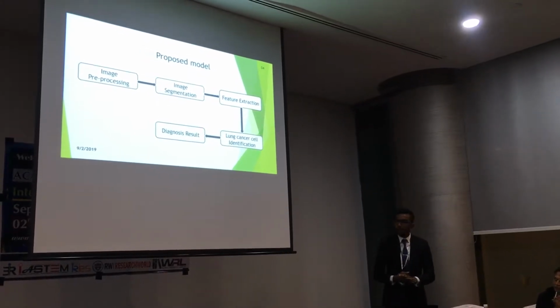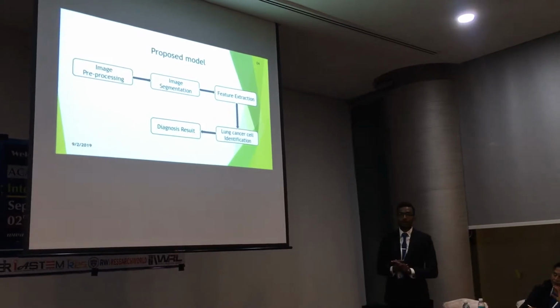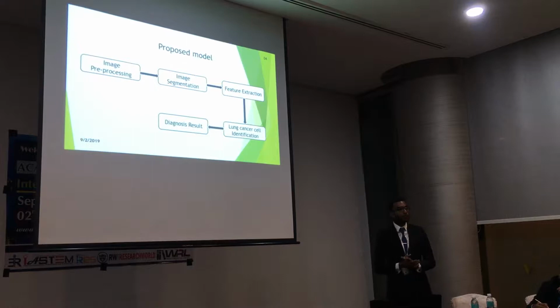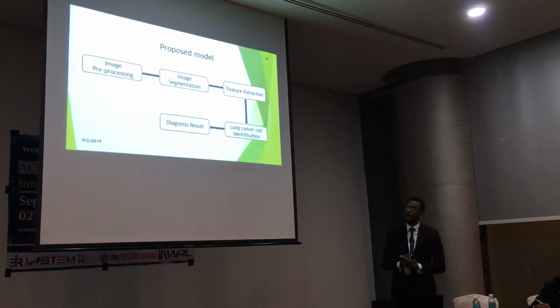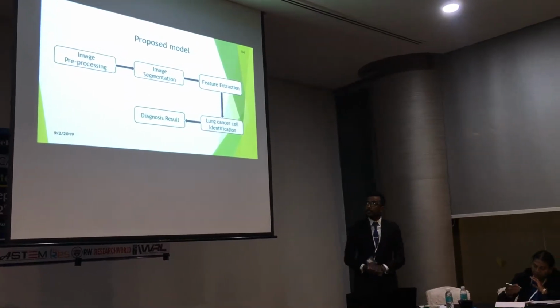Here you can see the proposed model for this work. This model starts with image pre-processing, then moves on to image segmentation, then feature extraction, then lung cancer cell identification through data mining, then represents the diagnosis result as a probability measurement. Let's start from the image pre-processing.